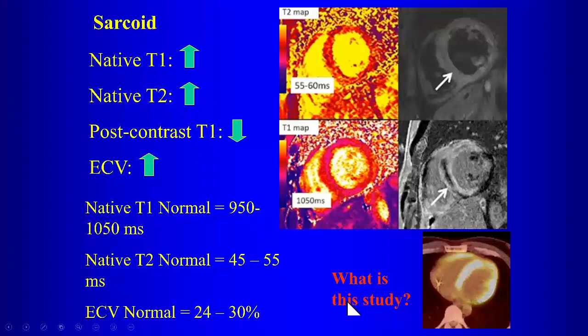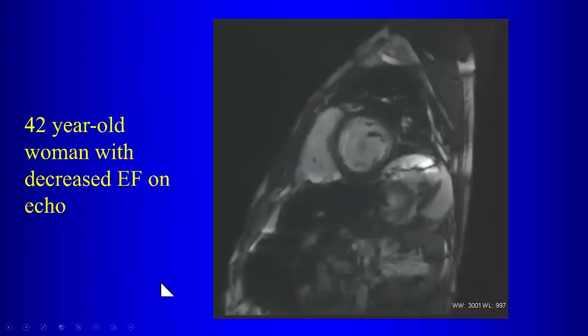Anybody know? It involves the preparation, right? So the patients have to be fasting for this, because you want to switch them away from glucose, myocardial glucose metabolism. So the preparation is very important. If you're going to evaluate a patient for myocardial sarcoid, the preparation for that is a prolonged fasting period before you do your PET CT. Okay. All right.